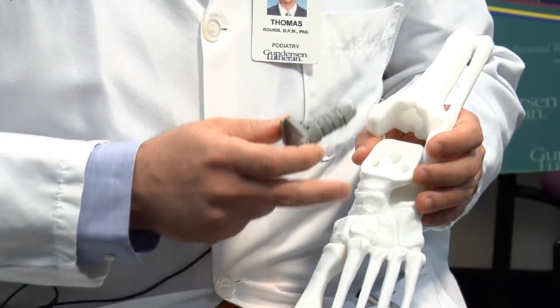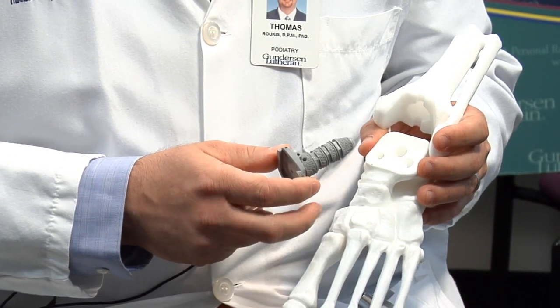Today I'm going to be speaking to you about the Prophecy In-Bone Preoperative Navigation Total Ankle Replacement. This is a model of a foot and an ankle, and I'm going to demonstrate the in-bone total ankle replacement.